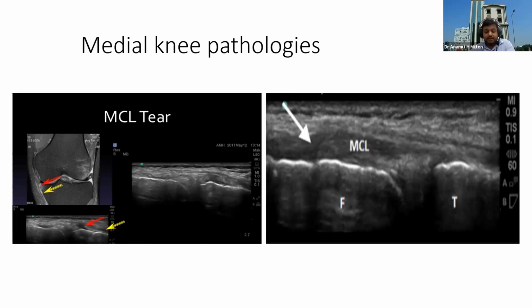Number one, inside the tendon there is microtrauma. If there are bony changes like these, it may be happening with osteoarthritis. And sometimes there are changes of the medial meniscus, and they are chronic, like for the last 6 months or last 1 year. So it is long term, not a very short history. If there are changes like this, you should always consider them long-term changes. That means they are chronic changes.